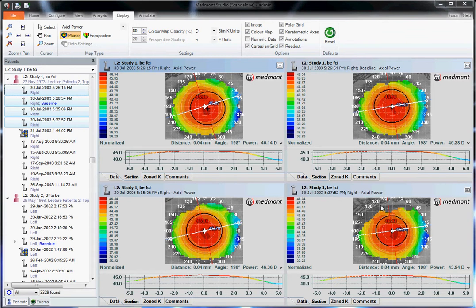Choose the map that has the largest fissure area. In this case, this image seems to have an upper lid blocking much of the upper cornea. Find the image that has the largest area of coverage, the smoothest contours, and appears to be a normal appearing topography.